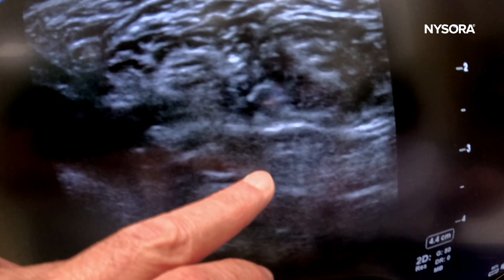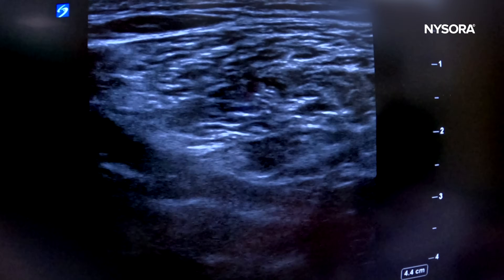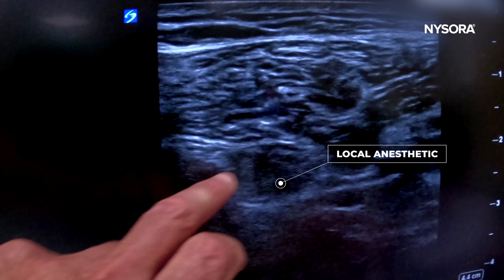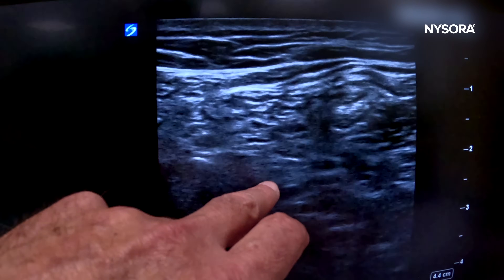Now go proximal. Trace the nerve more proximally into the gluteus. See how much the local anesthetic has spread — it's a beautiful, extensive spread as you follow the nerve proximally.